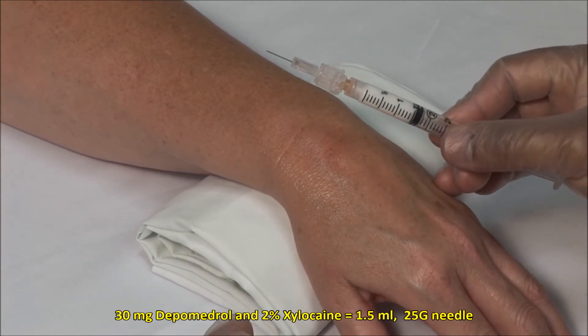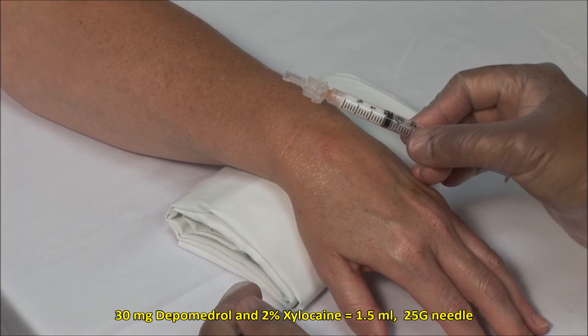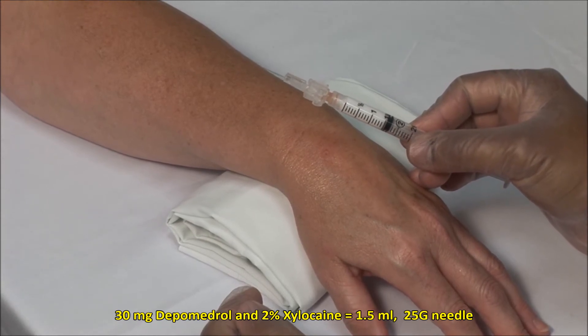Here I have a 25 gauge 5/8 inch needle and a mixture of 30 mg of depo-medrol with 2% xylocaine to a volume of 1.5 ml.